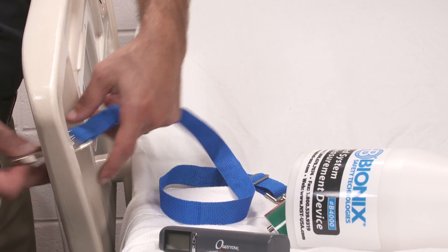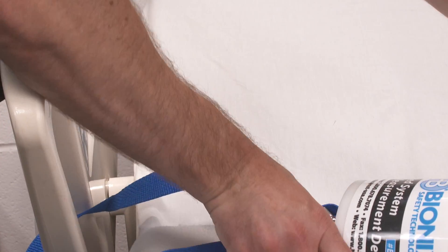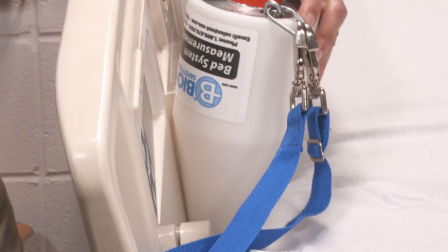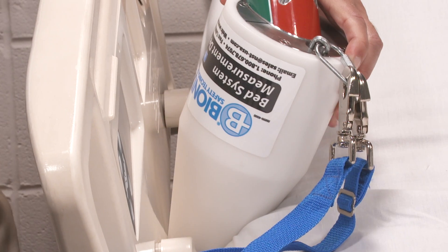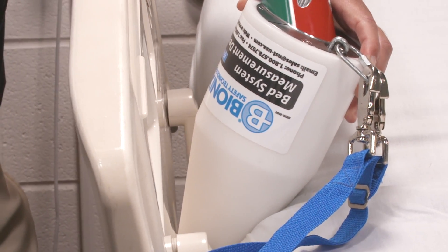Attach the safety strap of the cone to the rail you are testing to avoid injury should the cone fall. From inside the rail, insert the small end of the cone into the gap between the mattress and the lower edge of the rail, or between the rail supports. Let the weight of the cone compress the mattress on its own.